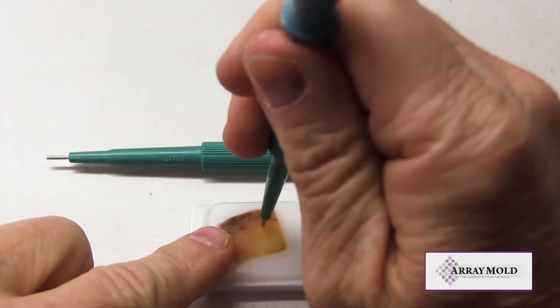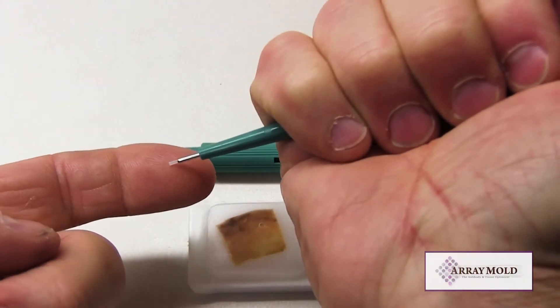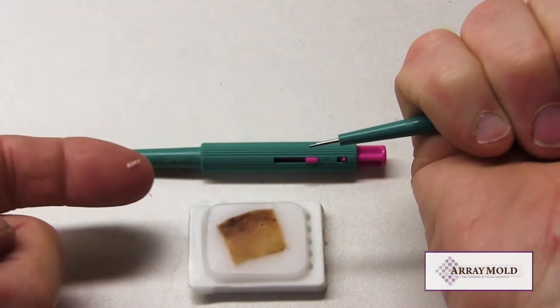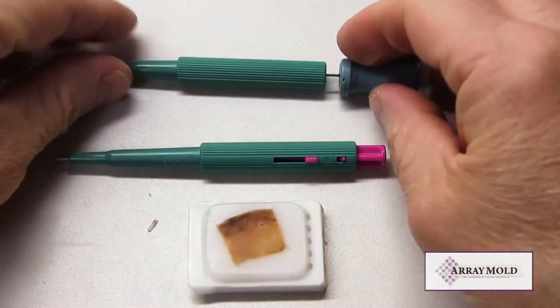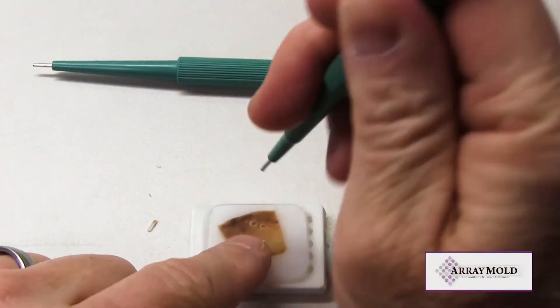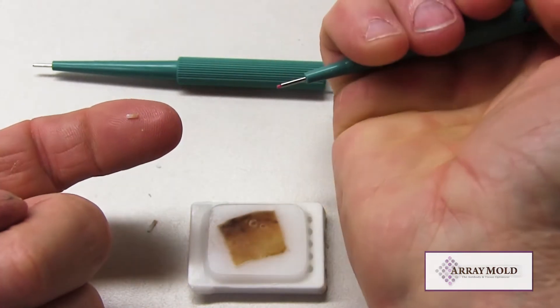Let's show an example of these two needles punching and extracting tissue samples. First we are using the needle with the stylet, or the needle without the plunger. Now we are using the needle with the plunger. As you can see, both needles function basically the same.